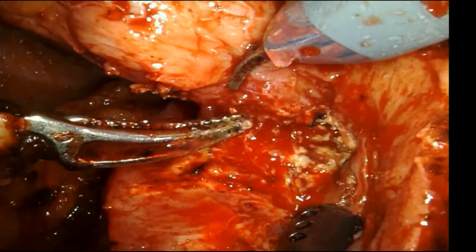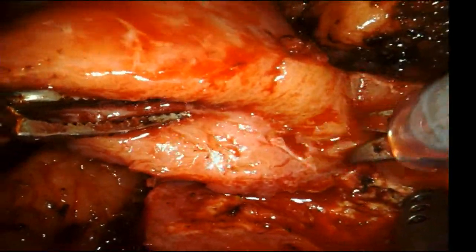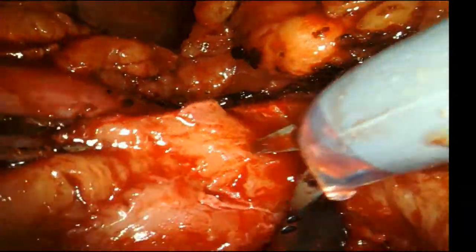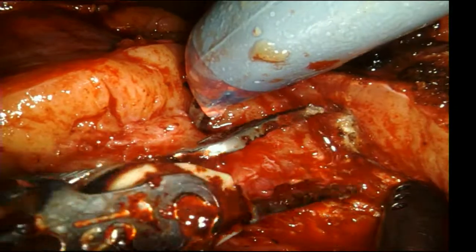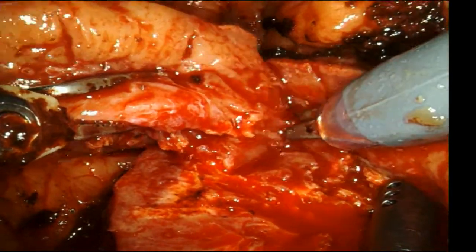And if I see any vessels as I'm going, I just buzz them. If I see any arteries, I buzz them. Veins, it doesn't work, but arteries, I buzz them, because then it's less work for me when I go to sew. I don't have to worry about those vessels as much, especially out here in the periphery of the parenchyma, because it doesn't really hold a stitch very well. So if you can buzz them before they're perfused again, it's going to help.